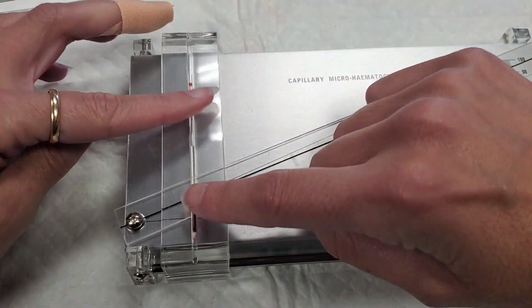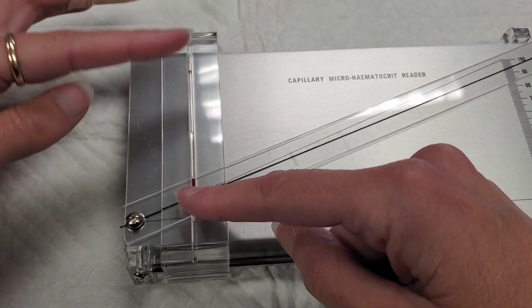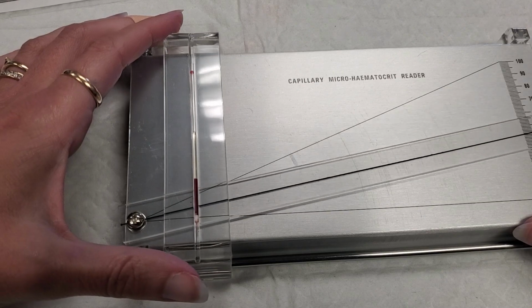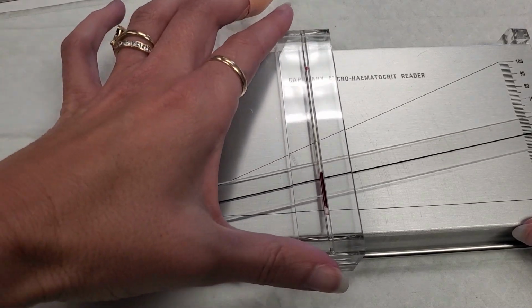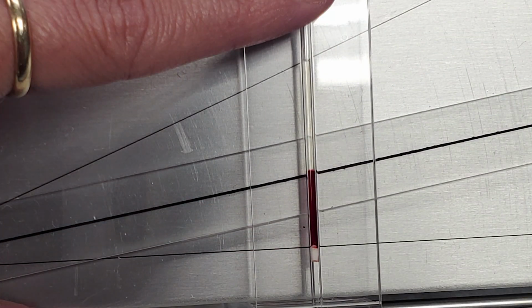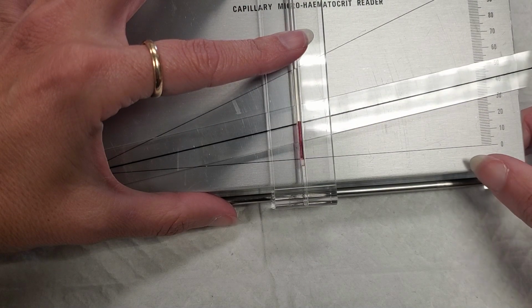Here's a look at a slightly different version of that hematocrit ruler. Same idea. You need to match the clay sealant with the very bottom line, and then what you're going to do is run the capillary tube until the very top of the plasma is going to hit the very top line as shown there, and then you use this adjustable line to match it to where the blood turns into the plasma. Follow that line out and it gives you the number. So in this case, the number looks like it's probably around 38 to 40.